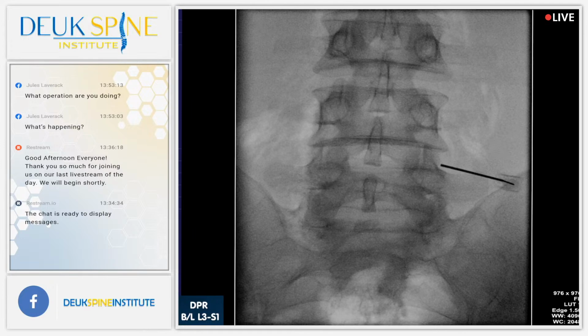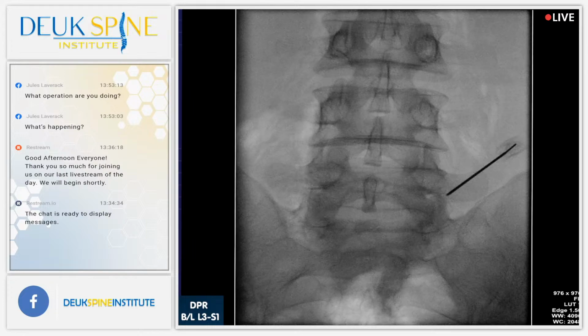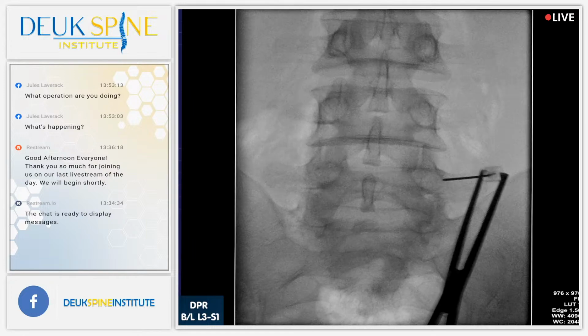You see a lot of surgeries done here on discs. He had a herniated disc at L3-S1, but when he came here, I realized he didn't have pain from the L3-S1 disc. His pain was coming from his facet joints. So to confirm that, we did a medial branch block, which is where we go in and numb up the facet joints to see if it takes the patient's pain away. That gives us a diagnostic test. And sure enough, his pain went away. So I told him, listen, your disc is not causing your pain, it's your facets. And that's what we're doing. We're treating his facets today.